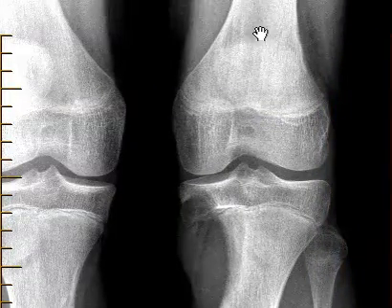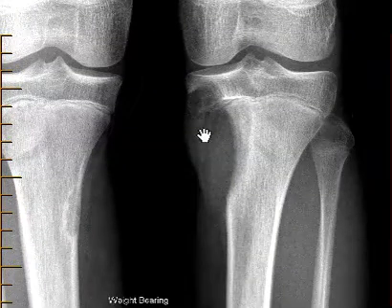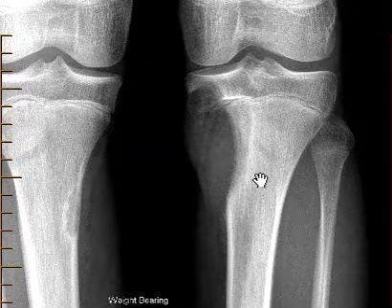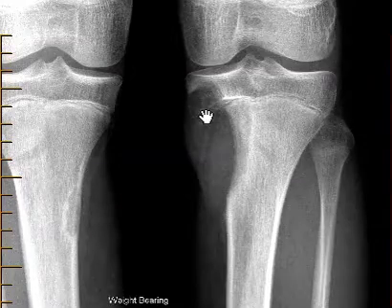If we get centered here, this is the femur, this is the tibia, this is the fibula. We see this bite out of the bone — there's a well-defined lesion. It involves the metaphysis, which is here. This is the growth plate, and the growth plate is not fused. The lesion also goes into the epiphysis here.